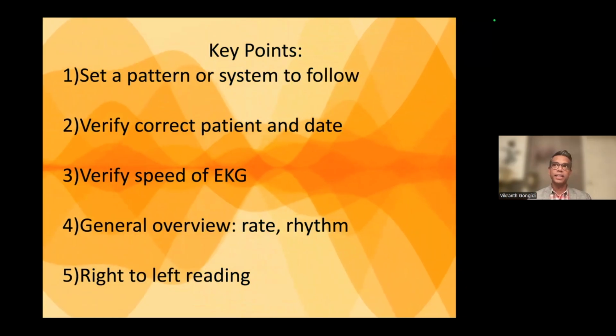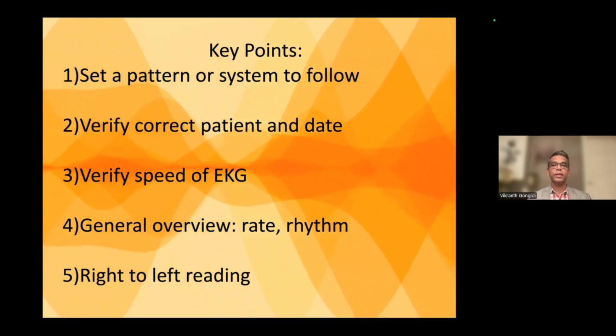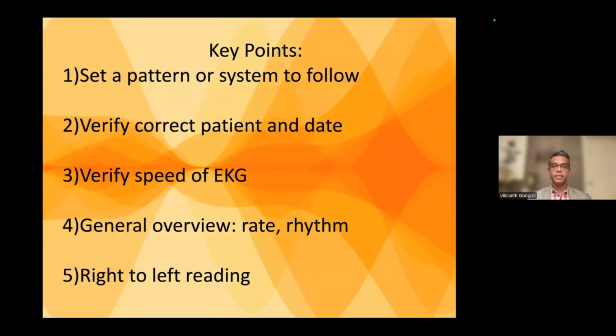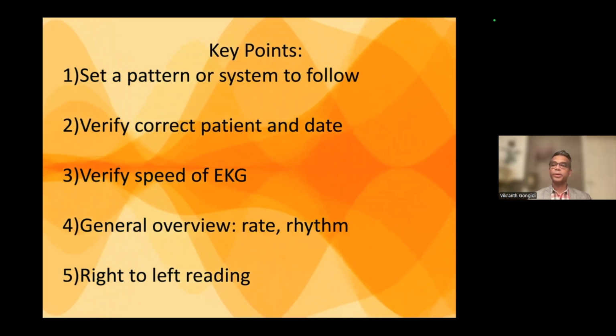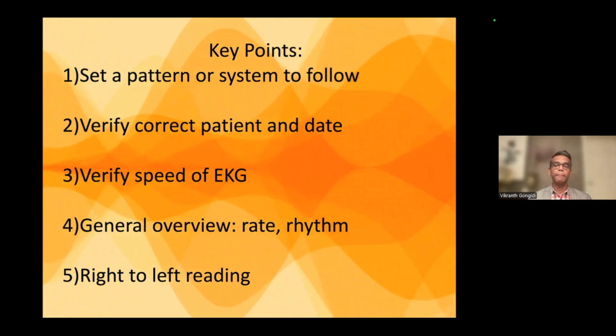I think it's happening less and less nowadays because most EKGs go directly into the EMRs immediately. But in case it doesn't, I just want you guys to be aware that checking the right patient, the right date, the right demographics is the very first thing you should do when you're reading an EKG.